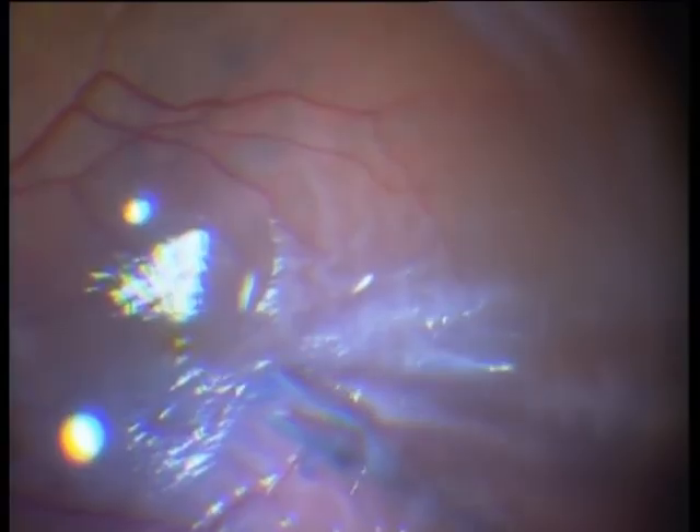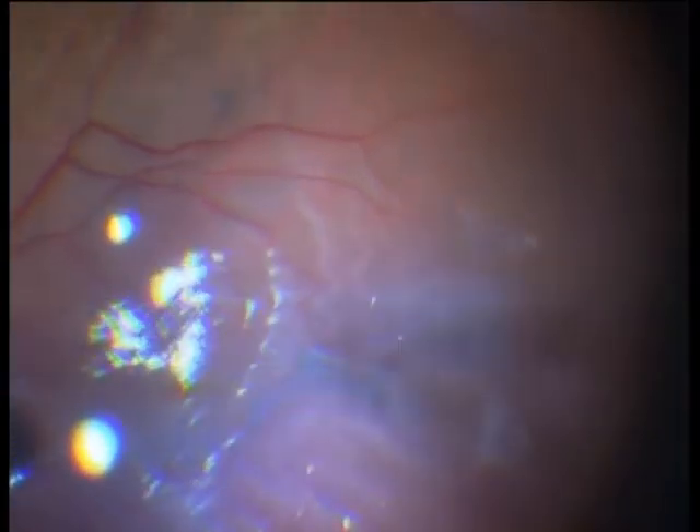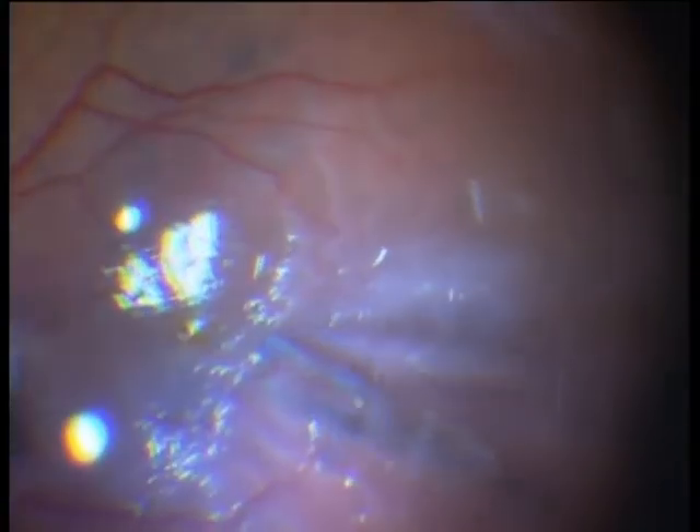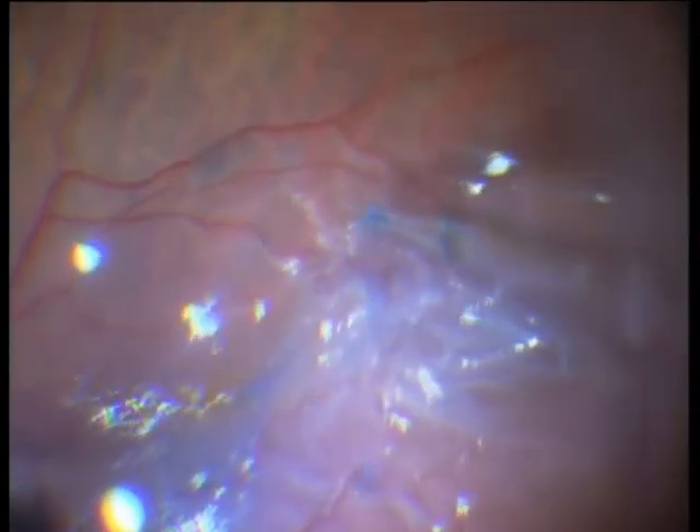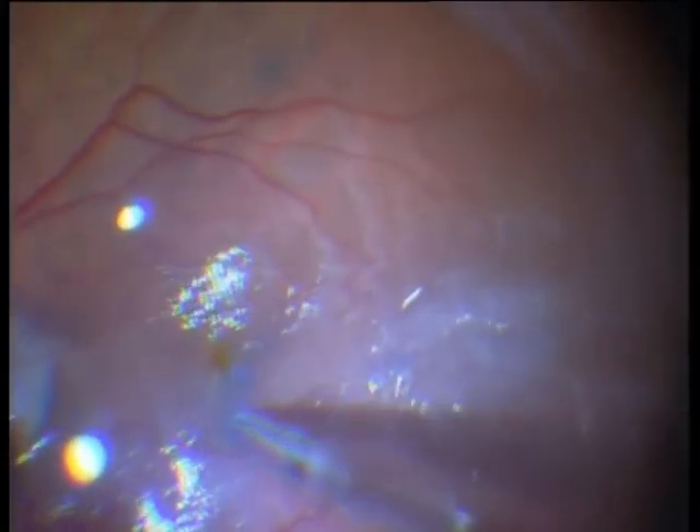Peeling under perfluorocarbon is more difficult than without, because visualization is worse and because the perfluorocarbon presses the membranes onto the retina — so you have no elevated parts of the membrane. It is a very, very adherent membrane. I am even using now a light pipe in the left hand to improve visualization of this membrane.